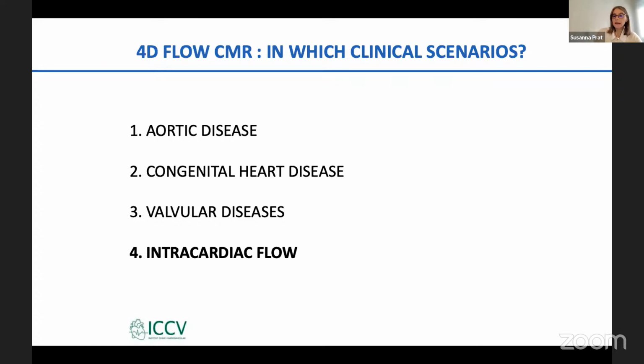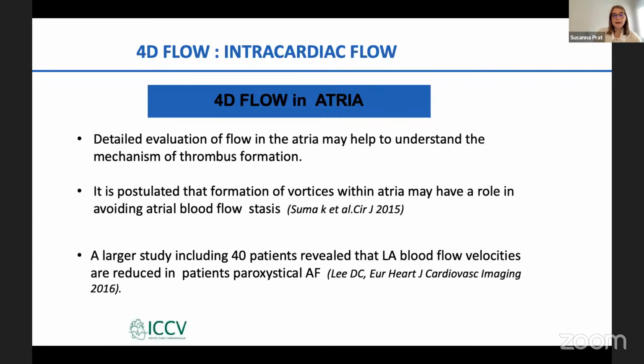And I consider that one of the roles of 4D flow in intracardiac flows will be at the level of the atria. Why? Because if we can get a detailed evaluation of the flow in the atria, it may help us understand the mechanism of thrombus formation. That is an important clinical issue.